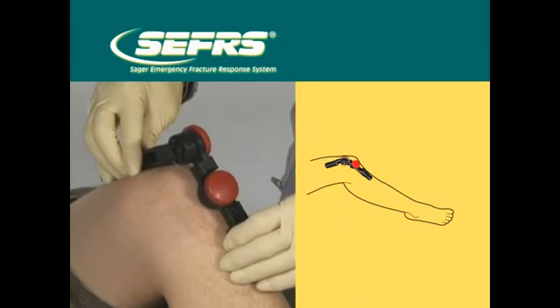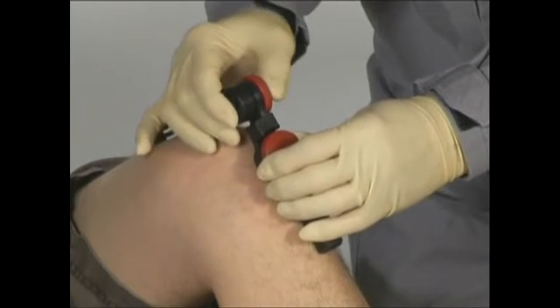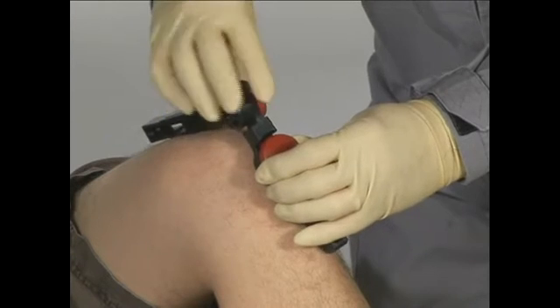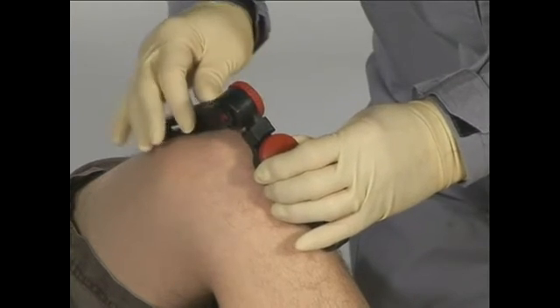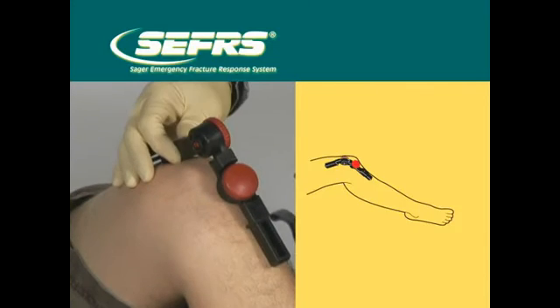Place the loose and malleable adapter on the fracture as shown. Make sure the arms of the device lay parallel, centered, and in line with the arms of the proximal and distal parts of the fractured limb. Lock the adapter arms, making sure the teeth are aligned, by turning the knobs tightly clockwise. If the teeth are not meshed and aligned and then locked into place, failure of the setting may occur.